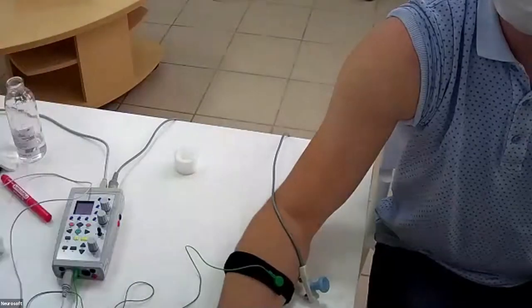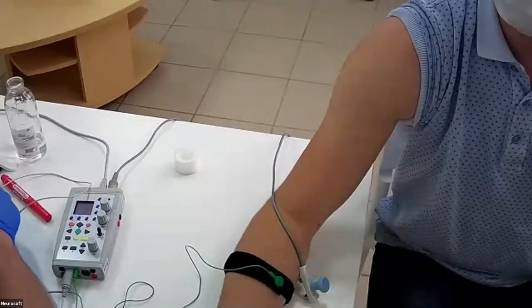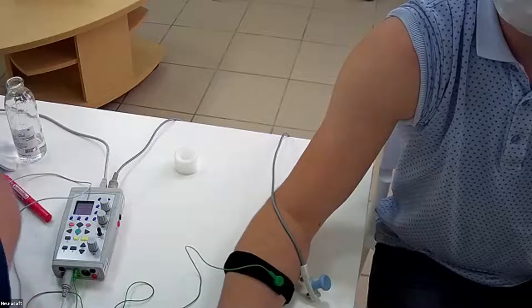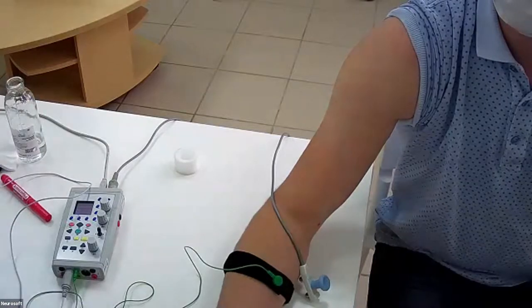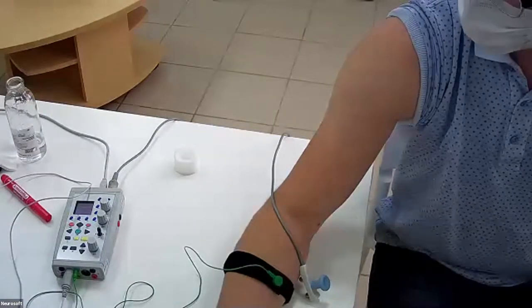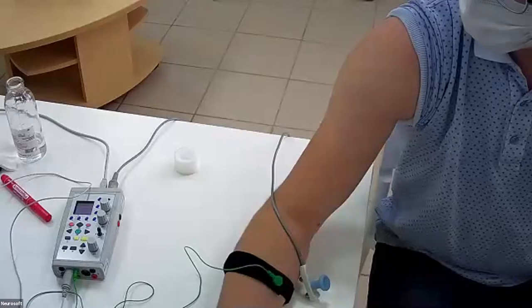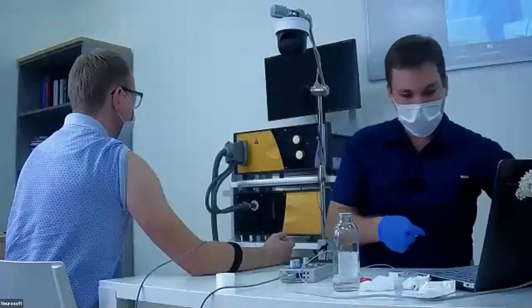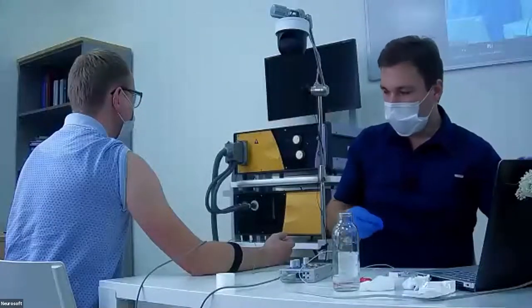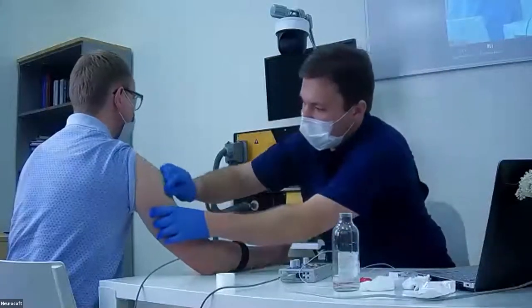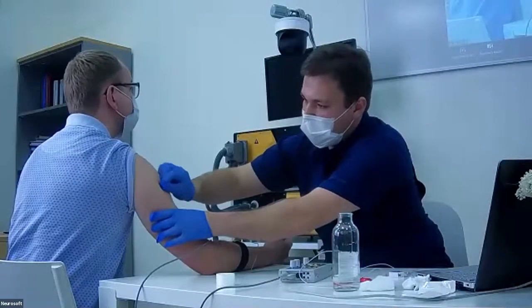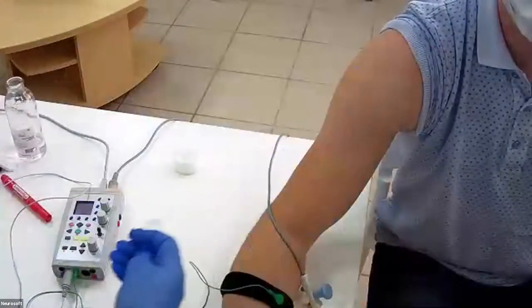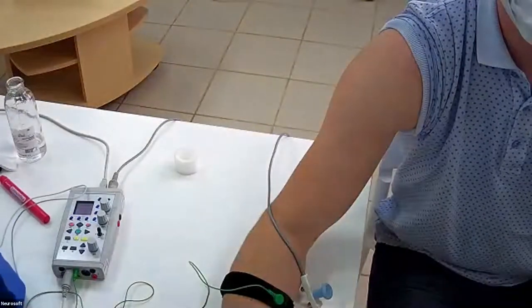For needle EMG, we certainly use only disposable electrodes. We swab the skin with alcohol or another antiseptic.